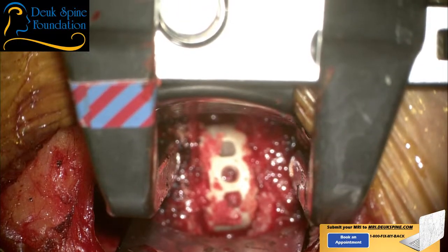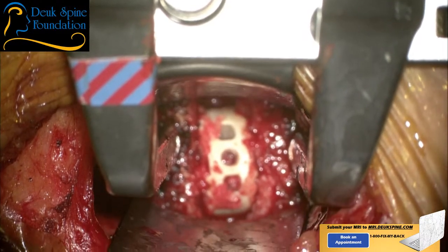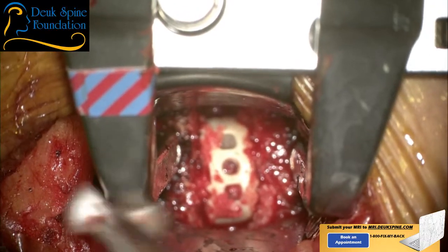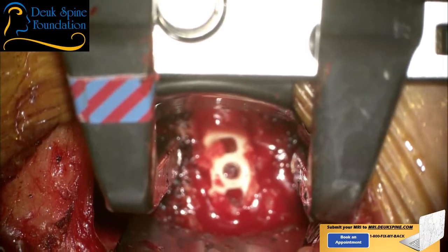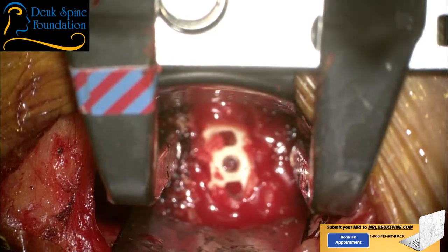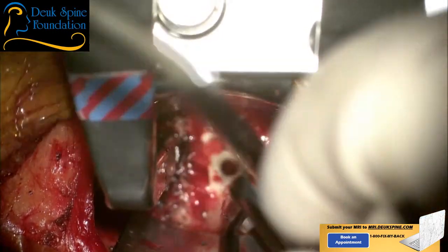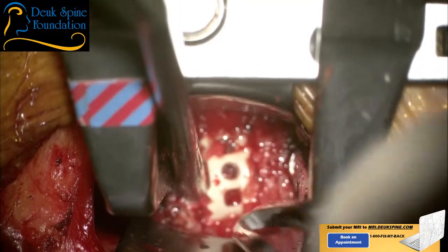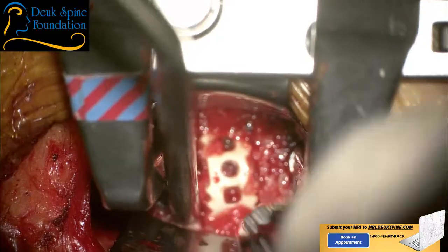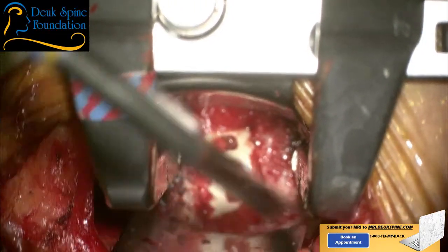Gel foam? Yes, sir. He does have a nice wider disc than normal, but I'm not going to gild the lily. I'm not going to make that mistake. I don't think there's any benefit to a wider cage. Biomechanically, I don't think there's any benefit compared to the smaller one, given the forces in the neck. The forces in the neck are not huge. They're not like the lower back.